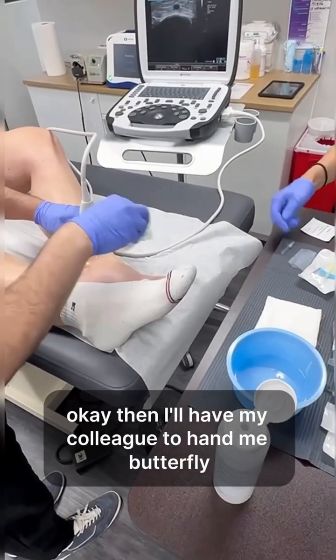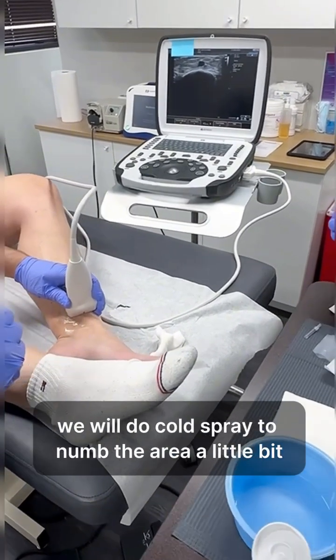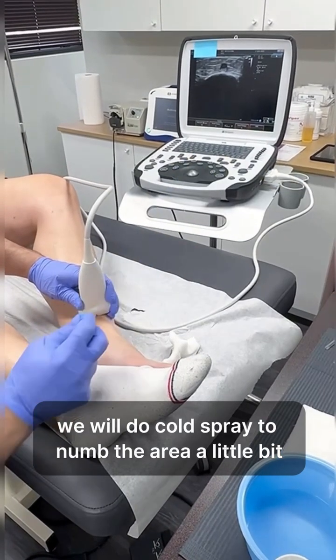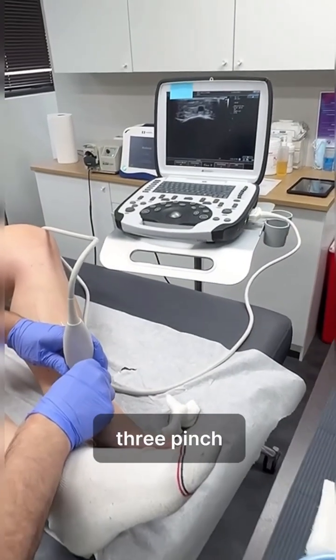I'll have my colleague hand me a butterfly, which is a tiny needle. We will do a cold spray to numb the area a little bit, and I will do a quick pinch. Okay, ready — one, two, three — pinch.